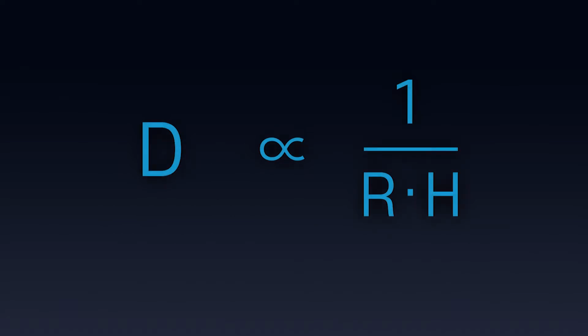The clear aligner and the thickness of the device can be summarized with this formula. D is distance of tooth movement. R, resistance of the tooth, alveolar bone, equals force applied to this device. H is strength of device, equals thickness, inch of device. The tooth movement distance is inversely proportional to the force applied to the device and the thickness of the device. The larger the travel distance, the thinner the device is required. The high resistance of the teeth also means the need for thinner devices.